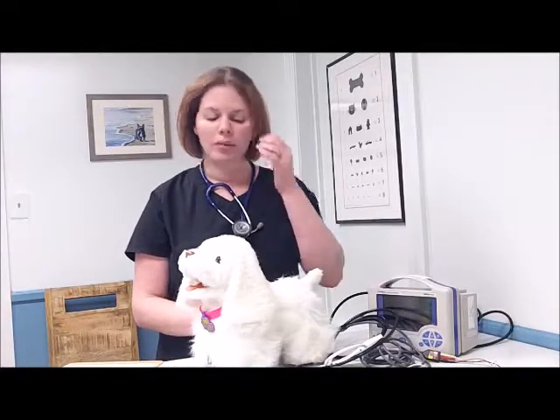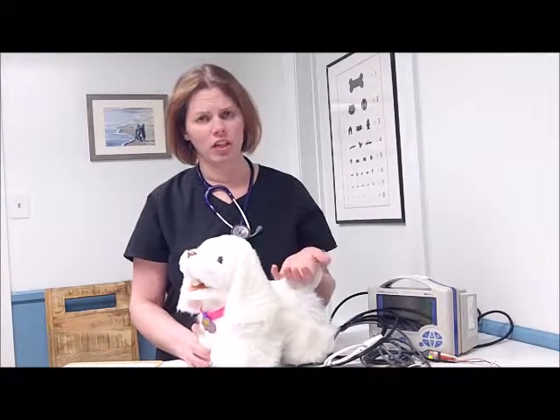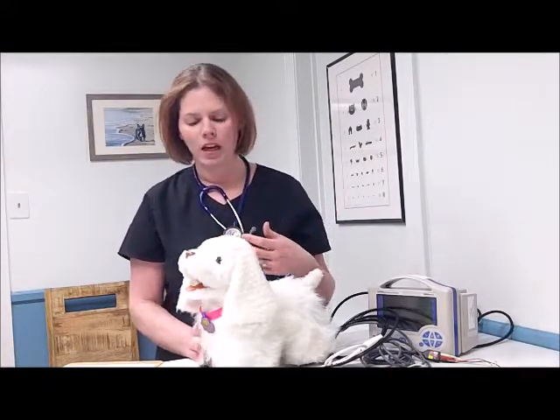This is very important for any kind of surgical procedure where aspiration could be an issue, even after post-dental procedures where there could potentially still be some fluid from the dental cleaning in the back of the throat. You definitely want them to swallow versus aspirating if you remove that tube too early and they go to swallow and it goes down the wrong tube.